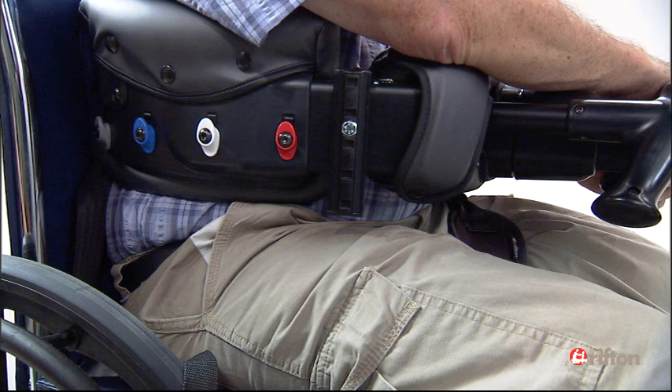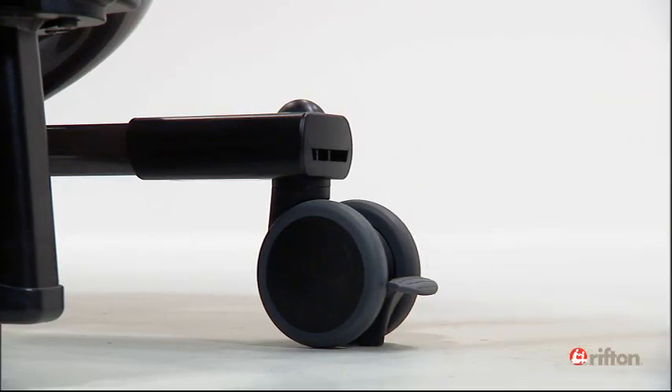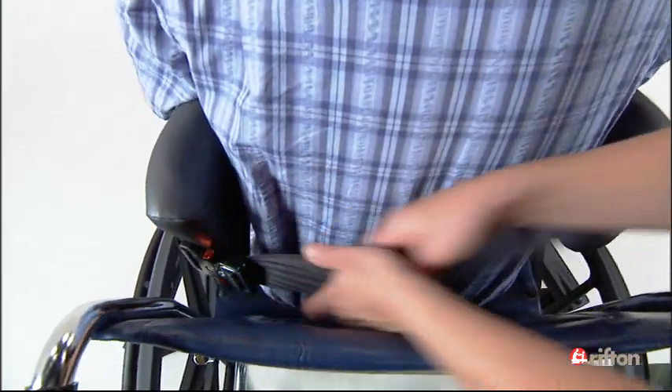The body support system should surround your client well below the armpits but above the hips. When in position, lock the brakes. Buckle the rear strap and tighten, bracing your free hand against the body support to ensure a very snug embrace.